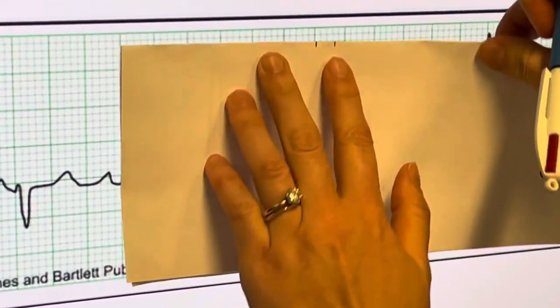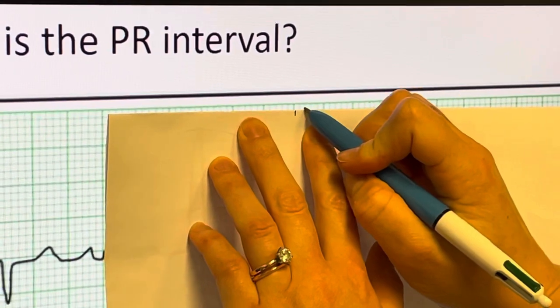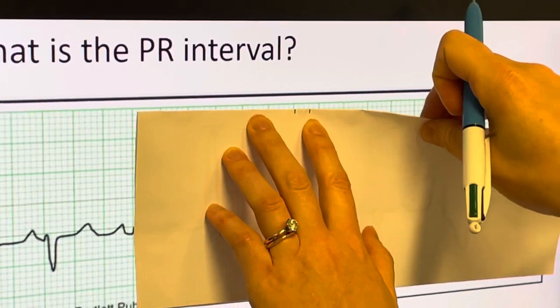I'm going to take my lines and move them up to a solid part of the grid. I can see that I have one, two, three boxes. And for my PR interval, that's 0.12 seconds.